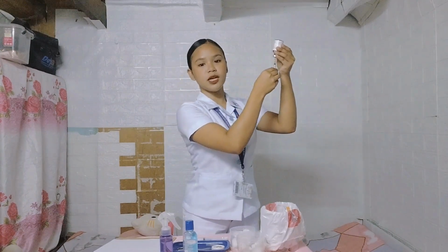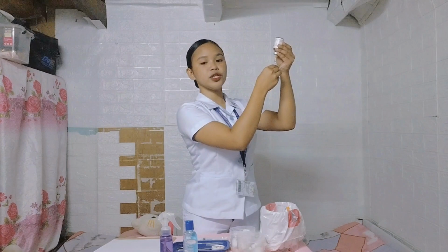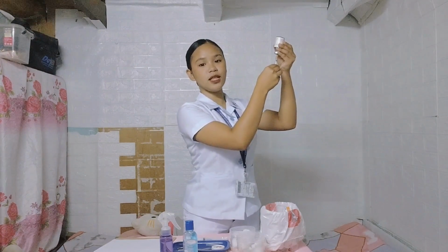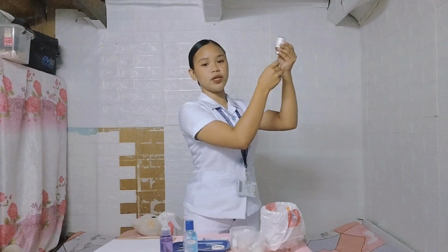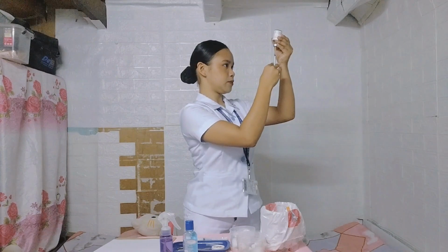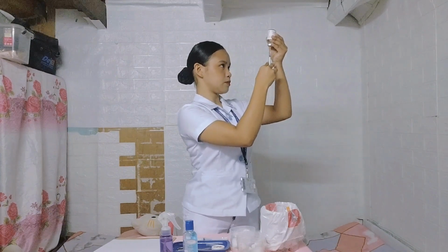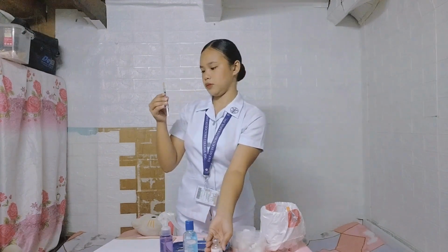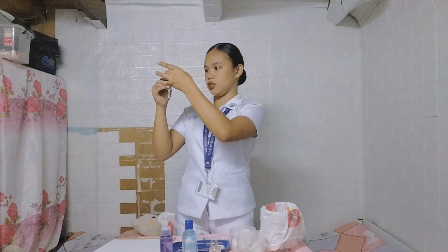Now withdraw the prescribed amount of medication. Invert the vial, ensure the needle tip is below the fluid level, and gradually withdraw the medication. If necessary, tap the syringe barrel to dislodge any air bubbles present in the syringe.